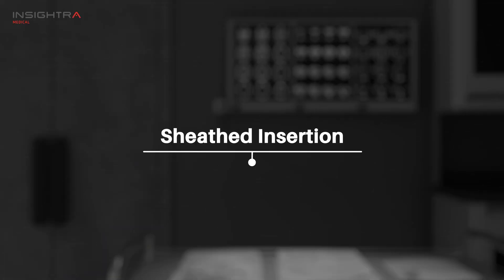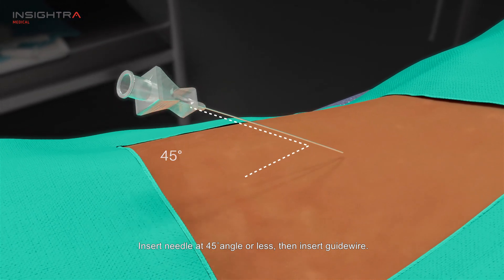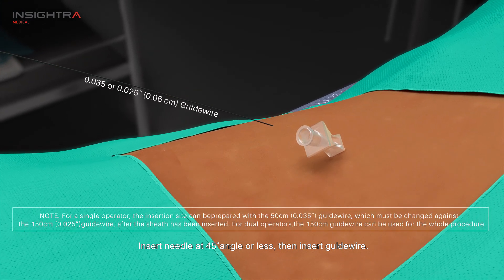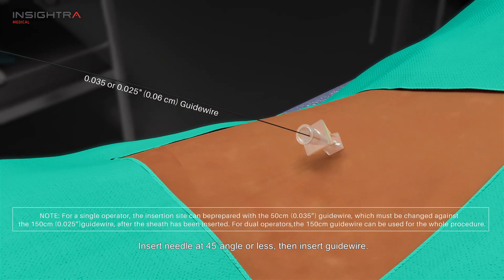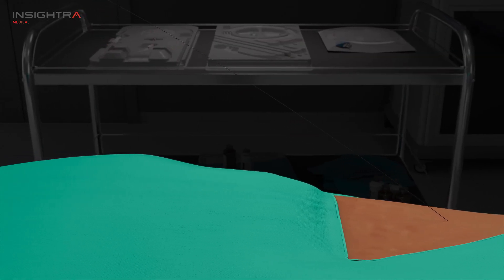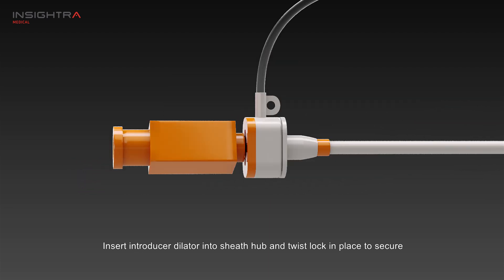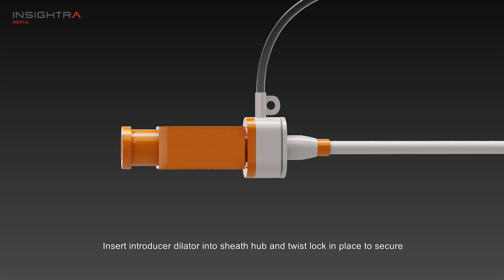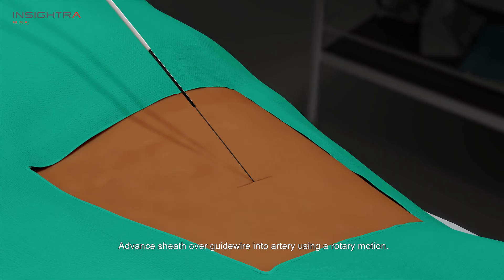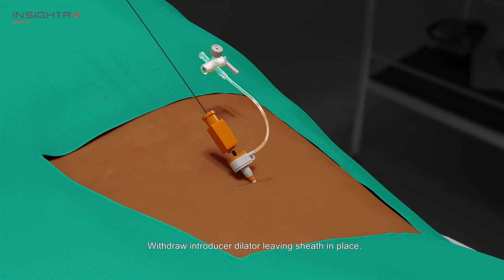Sheathed catheter insertion. Insert needle at 45 degree angle or less, then insert the guide wire. Insert the introducer dilator into the sheath hub and twist to lock it in place and secure it. Advance the sheath over the guide wire into the artery using a rotary motion. Withdraw the introducer dilator, leaving the sheath in place.